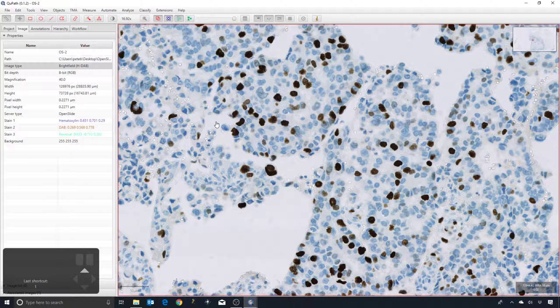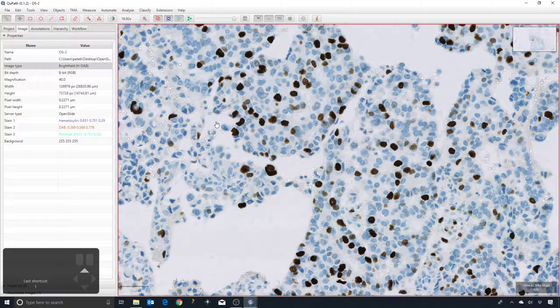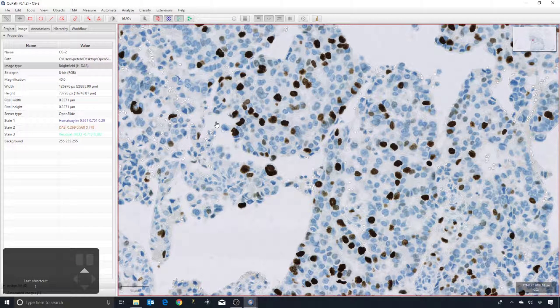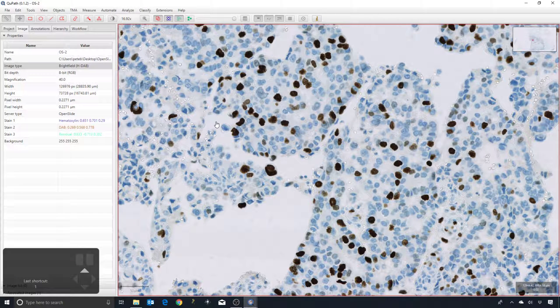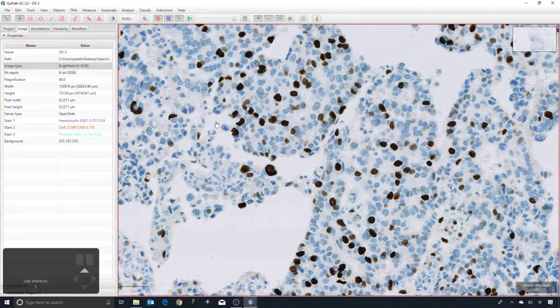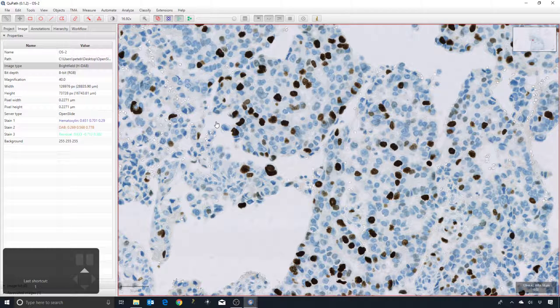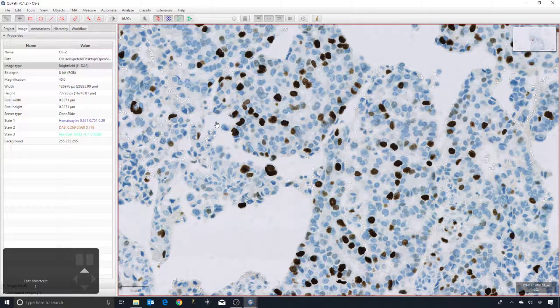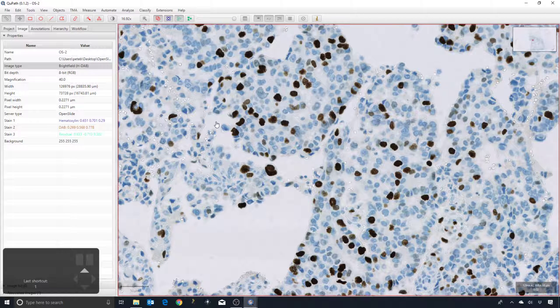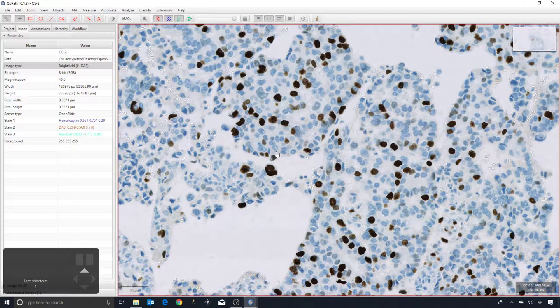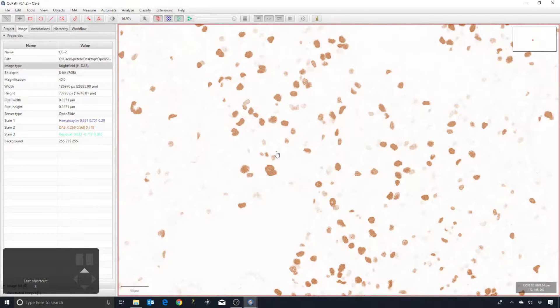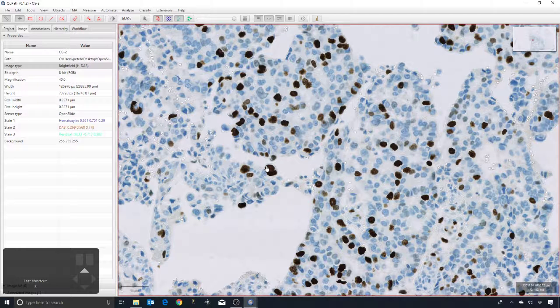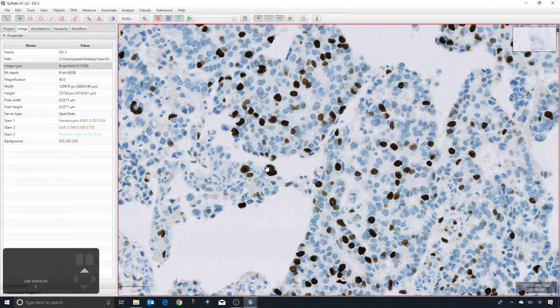We may be able to just run the analysis using these defaults and it may be okay. We don't want to over-interpret the accuracy of any of the values we get. If you had a mean hematoxylin value or DAB value, it doesn't necessarily mean very much in of itself, so it's not highly quantitative at all. But it still may be enough for us to categorize cells as being positive or negative.